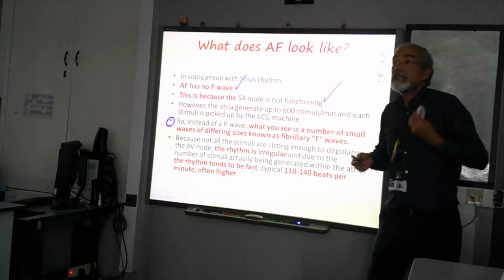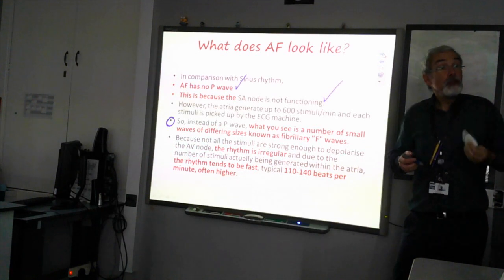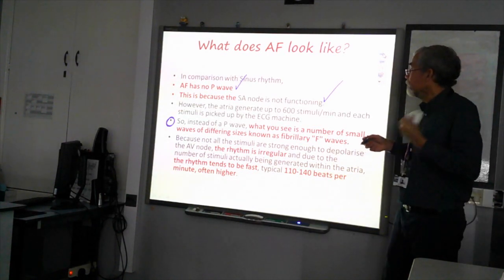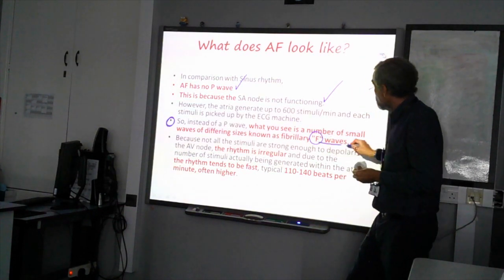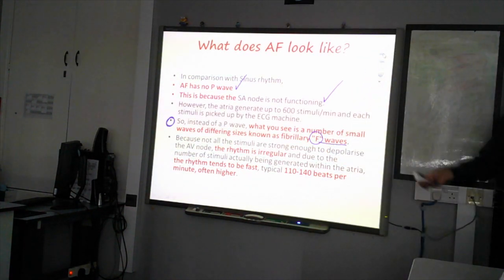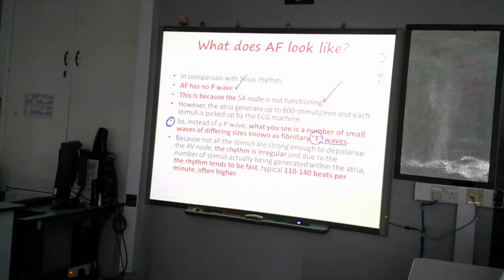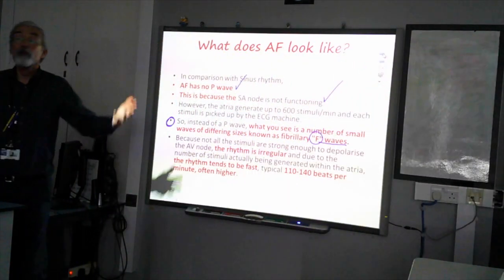Because I am a crazy conductor, I basically produce what we call F waves. And F stands for fibrillation. So it's kind of easy to remember, isn't it? Because I'm getting the heart to quiver. I'm getting the heart to fibrillate.